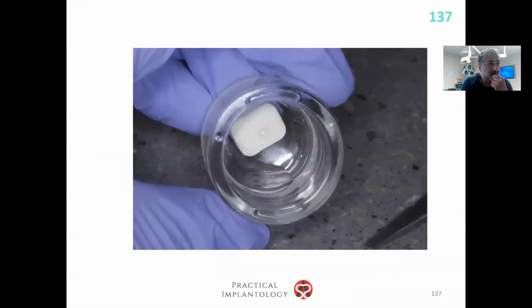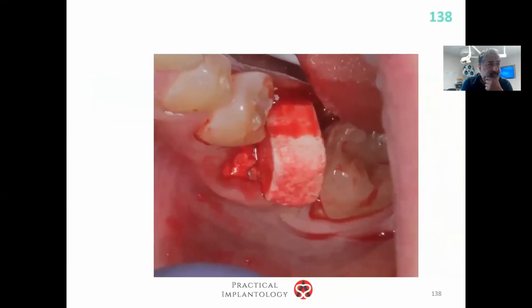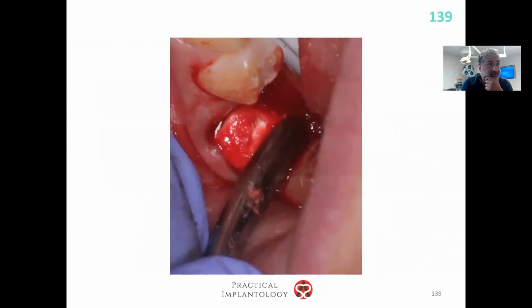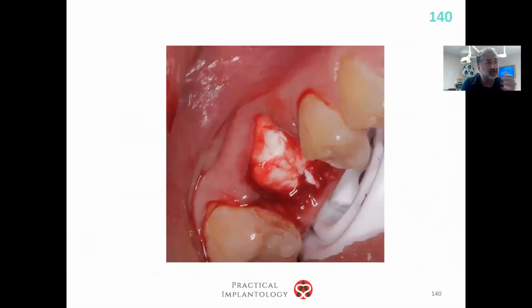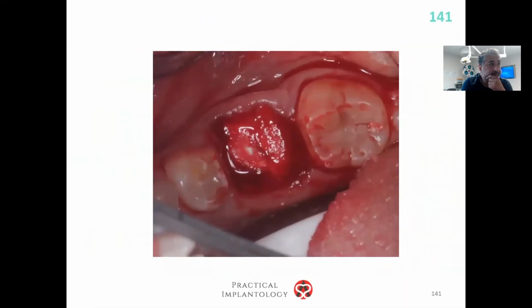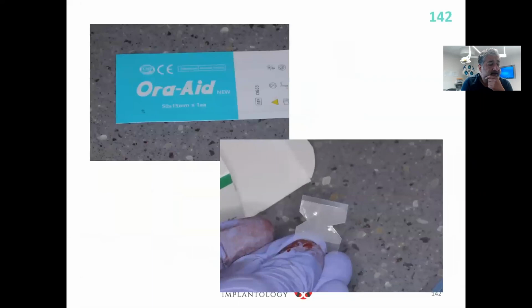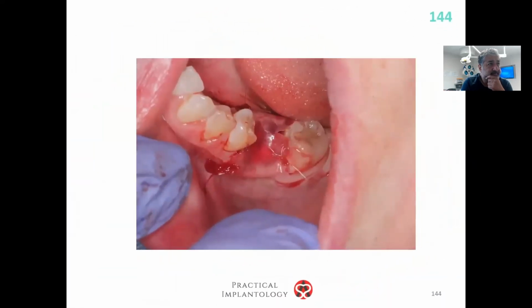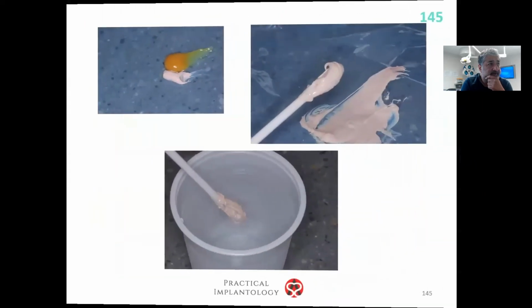We open the bottle, and it comes in this quite hard form. We just add a little bit of amoxil liquid, just dampen it, and we then push it into the socket, and you just place a luxator over the top, and you just put downward pressure. It will deform, and it will form fully into the socket like that. Beautiful. Again, I would get my Ora-Aid, and I'm suturing my Ora-Aid into place. And then I do my second protection.